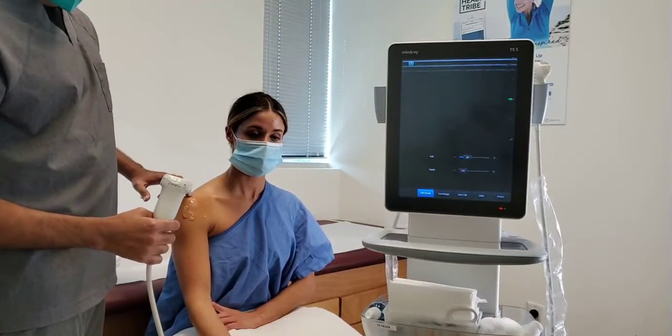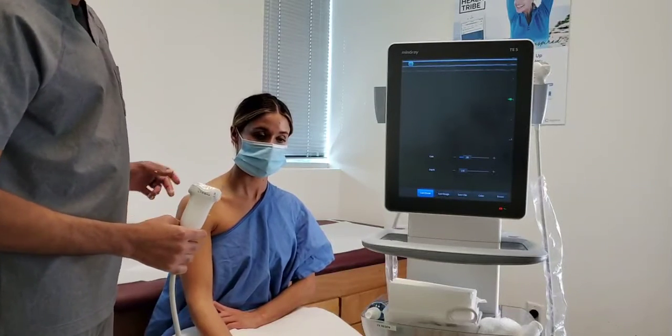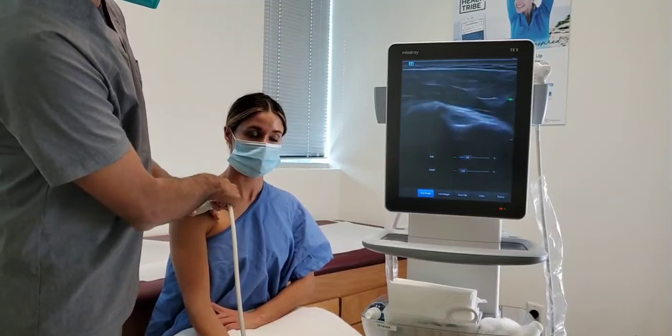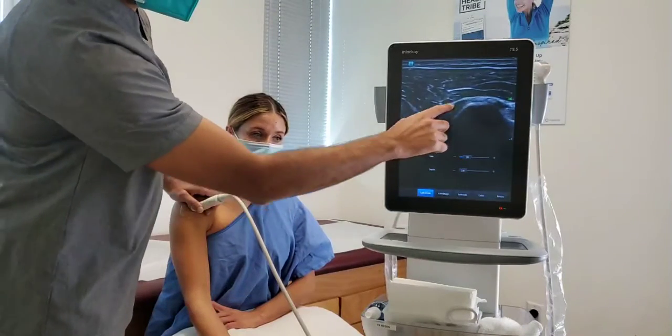There's one that's on the top called the supraspinatus, on the back of the shoulder the infraspinatus, and then the teres minor underneath that. So from the biceps tendon, we can then look at the first part of the rotator cuff, which is right over here.